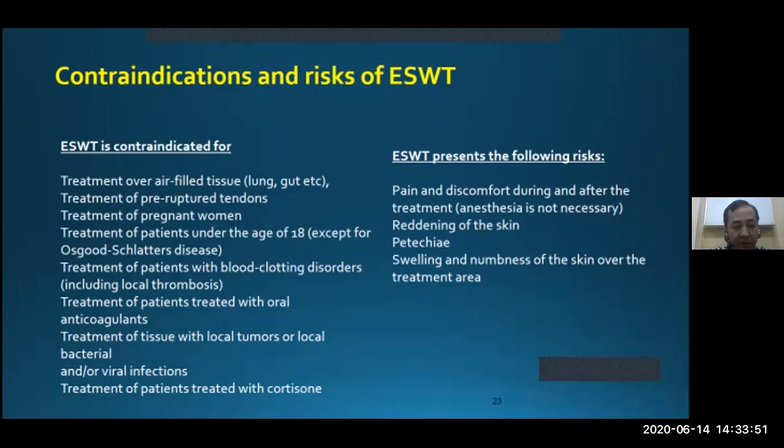And treatment of patients with blood clotting disorders, including local thrombosis, treatment of patients treated with oral anticoagulants, treatment of tissue with local tumor or local bacterial or viral infection, treatment of patients treated with cortisone. And the side effects of shockwave are like pain and discomfort during and after the treatment. Anesthesia is not necessary here, I will talk about it later. Reddening of the skin, swelling and numbness of the skin over the treatment area.